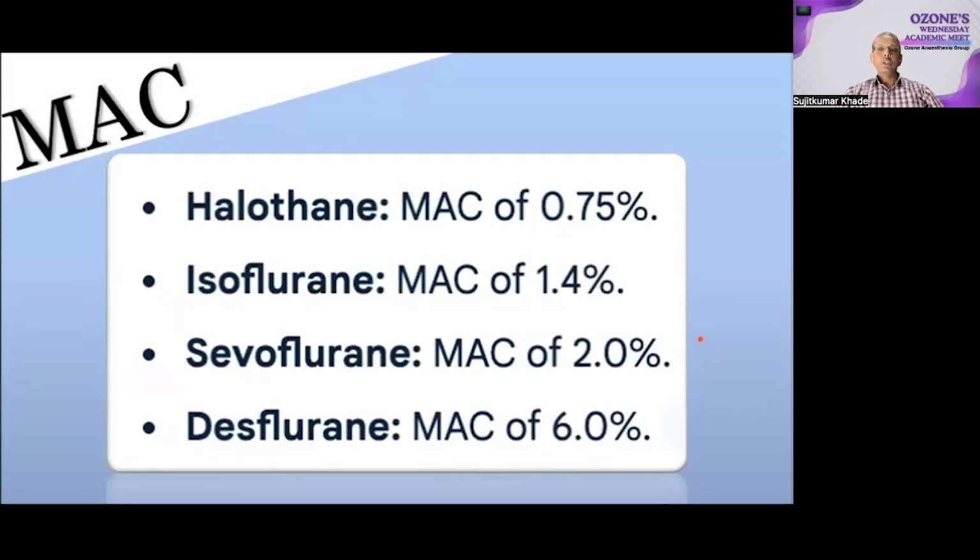If we want to use inhalation anesthetics to prevent intraoperative awareness, then we should use an end-tidal anesthesia gas monitor for correct MAC values. MAC values are calculated from the expired end-tidal concentration of anesthesia gas and the age of the patient. So it is a calculated value.